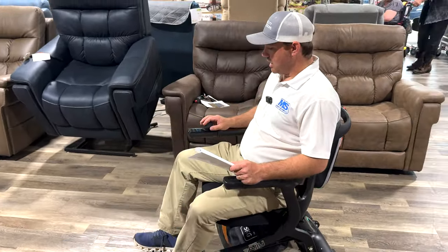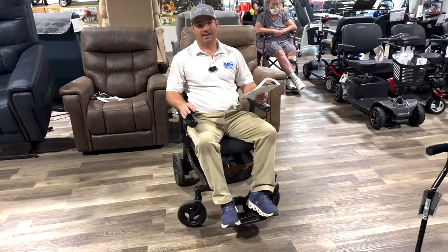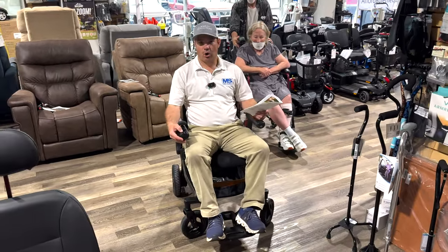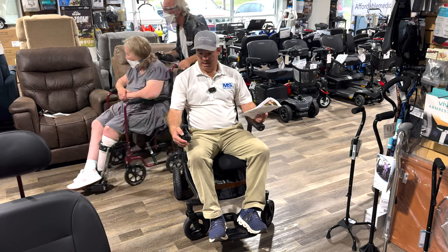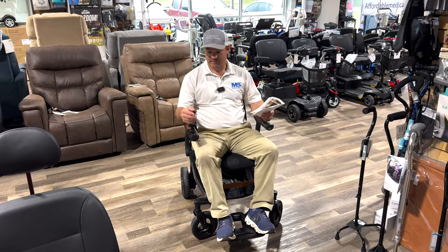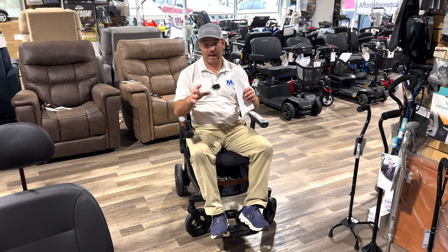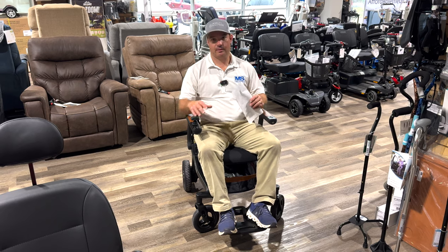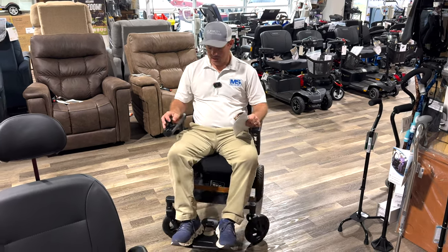Now it has a little bit of talking to you when you're reversing, but it's not like a beep, and it's really short, so that's not a big deal. It has like a car horn to it. And then it has some SOS button. I don't know what it does, but I guess it's going to alert someone maybe through the Bluetooth. So we're going to go through the Bluetooth, the app that they have, and they might have a certain direct contact to your mother, your father. I'm not sure yet, but I think that's what the SOS is.